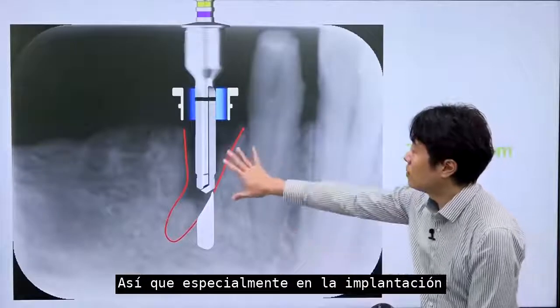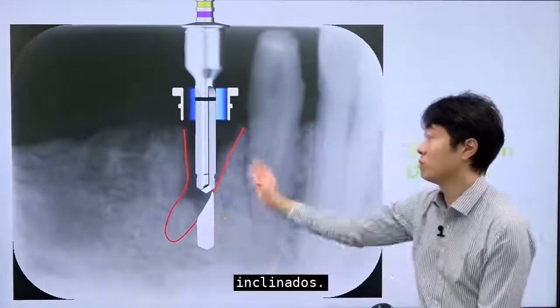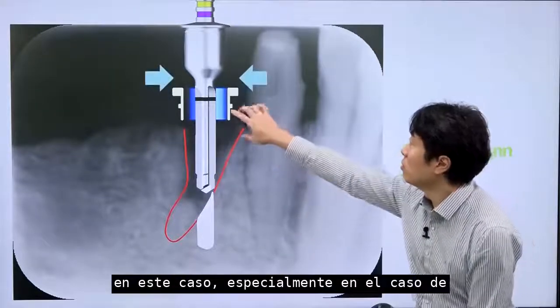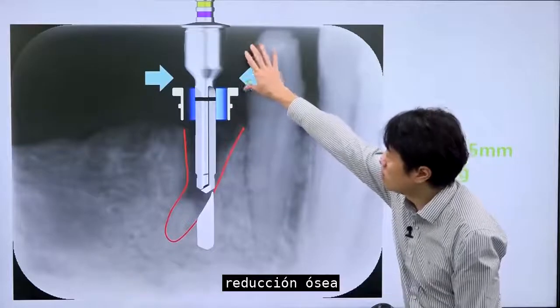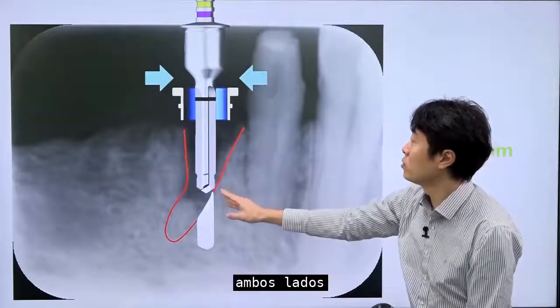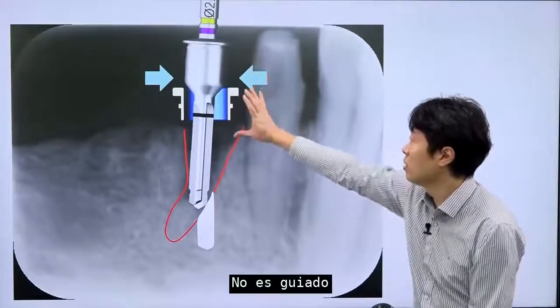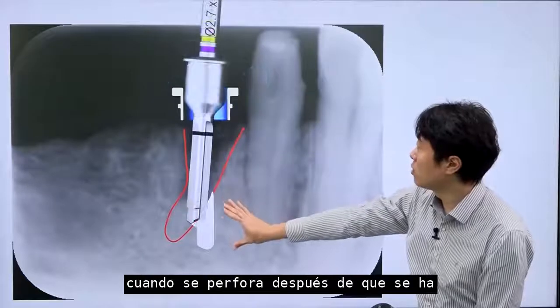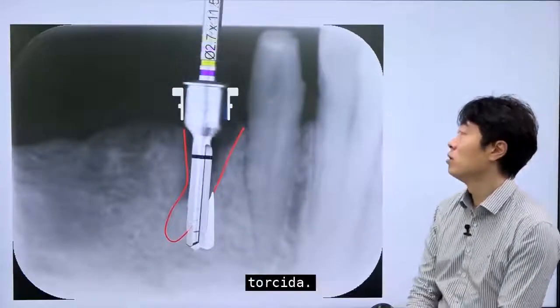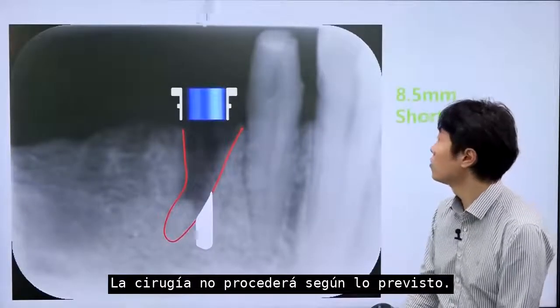Especially in immediate implantation, many cases involve inclined cortical bones. In this case, especially in an unguided state, when bone reduction begins, the drill slips after bouncing on both sides. Here too, it's not guided. When it is drilled after it has slipped, as I mentioned before, drilling will be done slightly crookedly. The surgery will not proceed as intended.